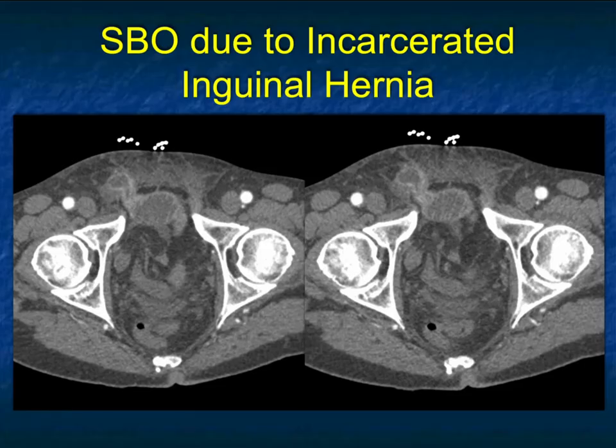Now, other things that cause obstruction are, of course, hernias. I showed you a really nice example of a hernia into the lesser sac. But hernias, as a result of surgery like laparoscopic surgery or other surgeries, are all possibilities. So let's stop here and come back, and let's talk about hernias and the range of hernias we see on CT causing small bowel obstruction. See you in a few minutes.